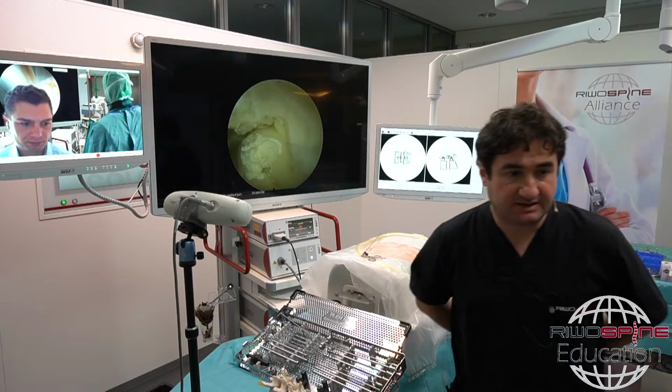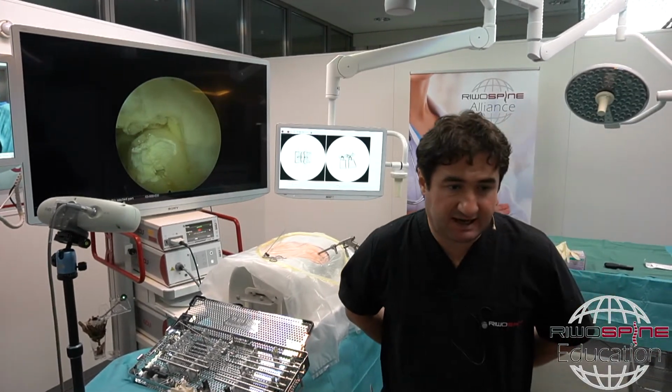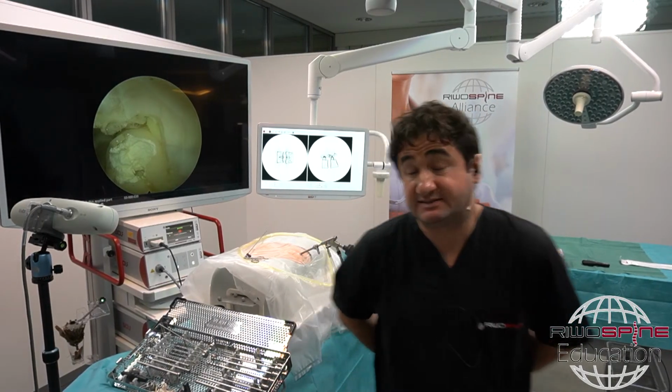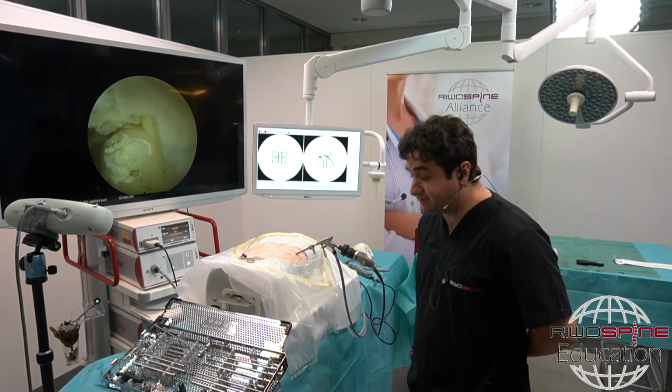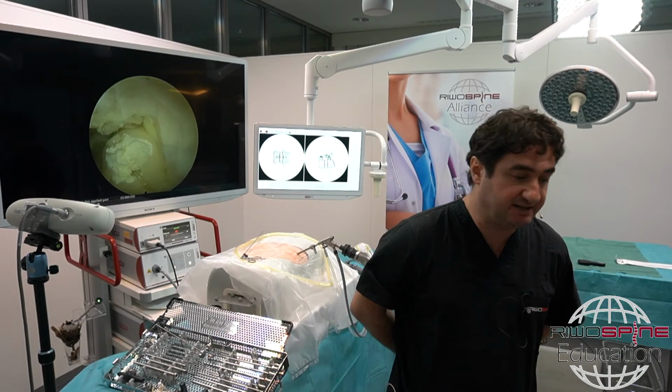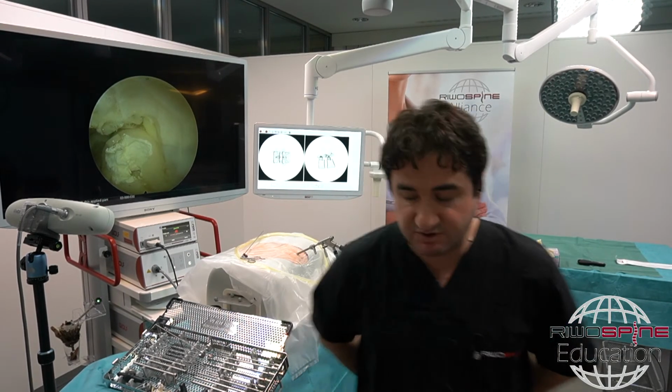Yeah, right. Okay, another question. What is the approach if extraforaminal L5-S1 disc? Definitely it will be extraforaminal approach. Yeah, you cannot reach the extraforaminal area with the interlaminar approach. Then you need to do transforaminal approach.